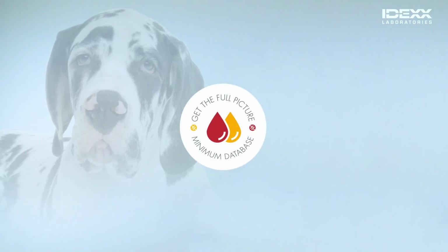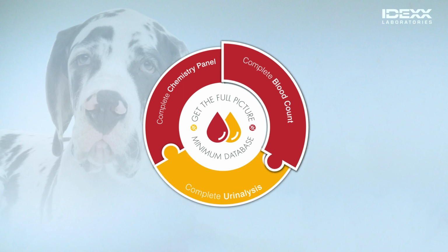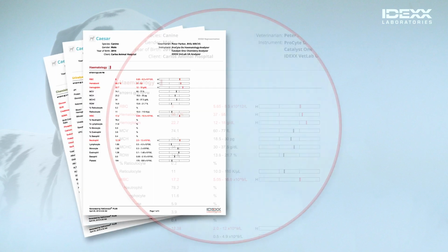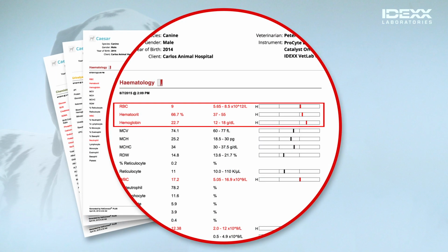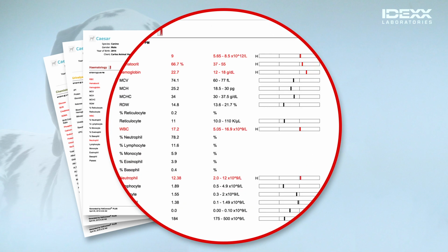So if we took a second option and we actually did a minimum database where we get more information, and we look at a full hematology, biochemistry, electrolytes and urinalysis, let's see what additional information we could have gained in this case. Looking at the hematology, we again see that we have the evidence of the hemoconcentration with the elevated red cell parameters. We also have a mild leukocytosis and a normal platelet count.